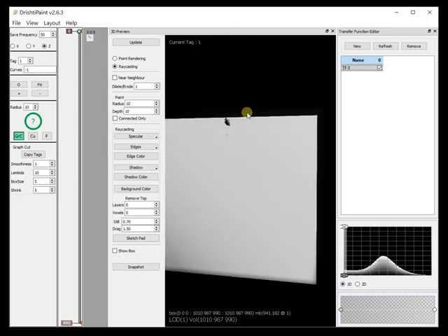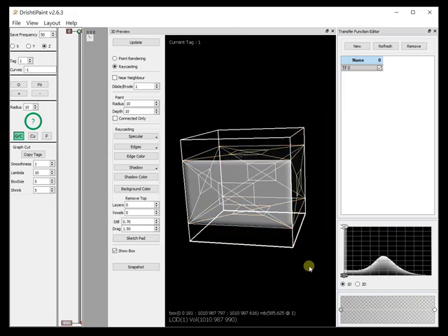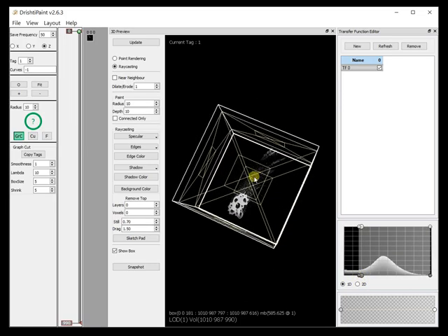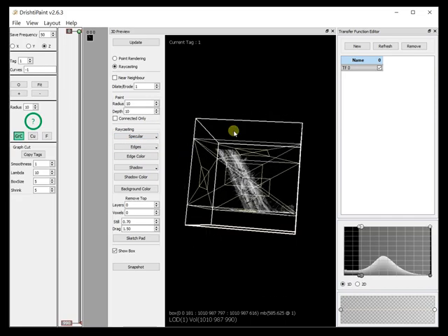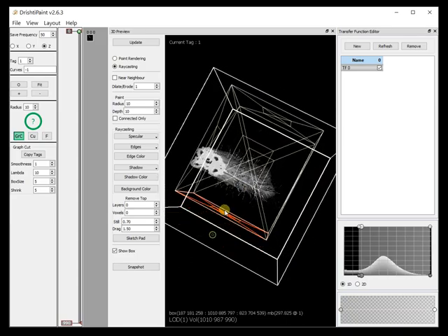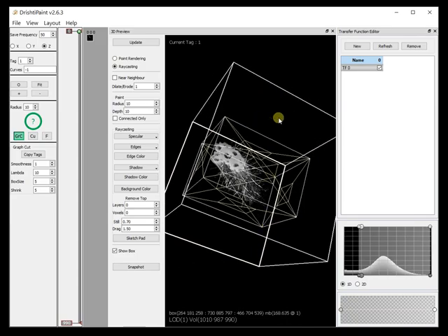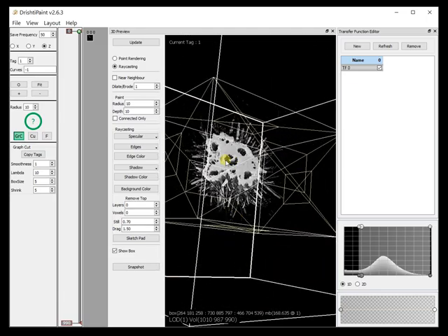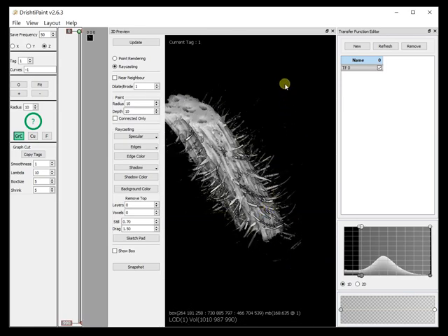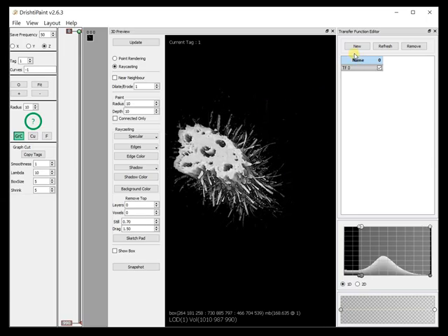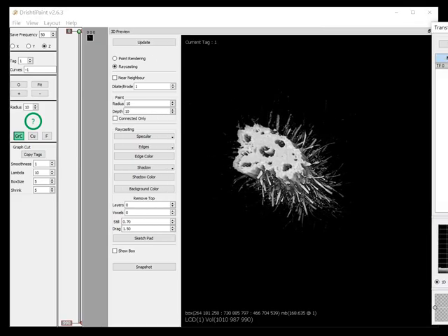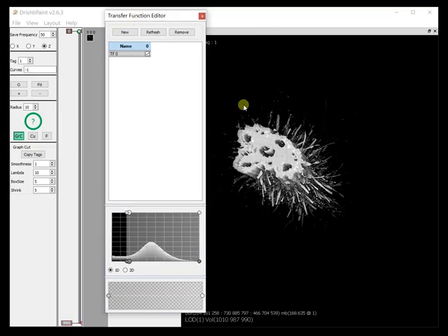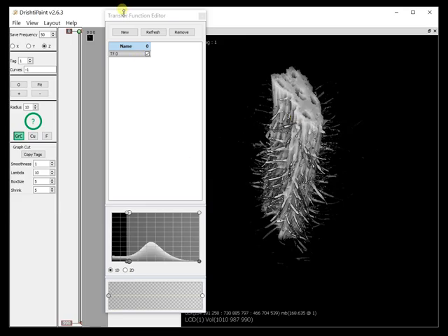Let me just reduce the box. This is the stem and we would like to get the volume occupied by these vessels. In order to do that we will have to segment these vessels first and then get the volume. To segment these vessels we will shrink wrap around this stem and then extract the vessels.